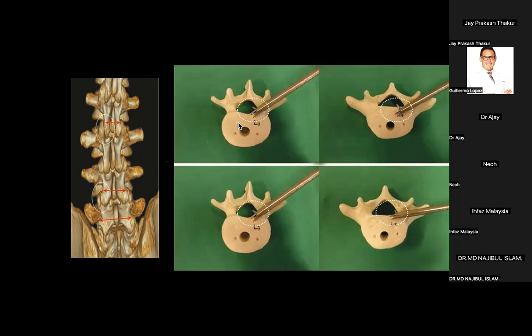So if you have to target a fragment which is paracentral over here or subarticular over here, this vertical angulation will be sufficient for the L2, L3 level, but this is not sufficient for L5, S1 or L4, L5 level. If you go that steep inside, you may enter the disc. You will miss your fragment over here. For this, you have to go more horizontal. That means more horizontal means more distance from the midline. Understood?